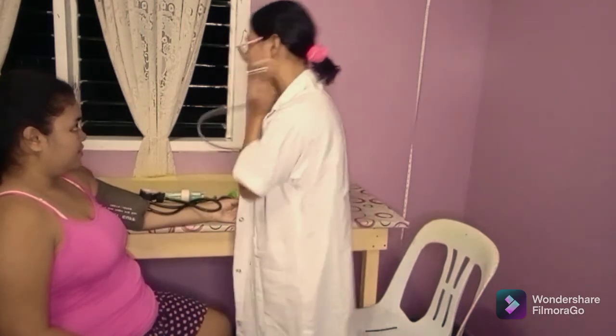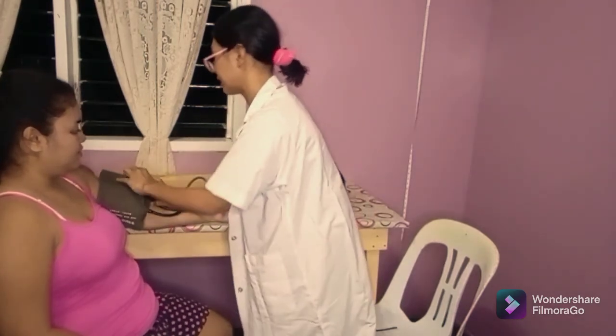Okay, ma'am, so your blood pressure is 120 over 80.